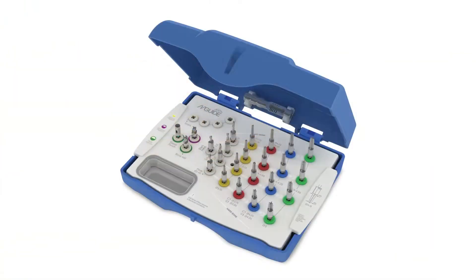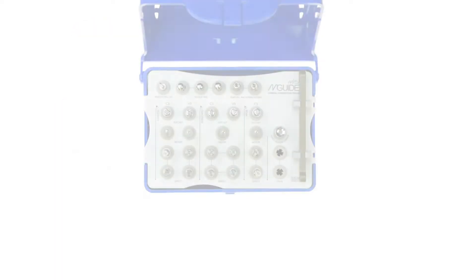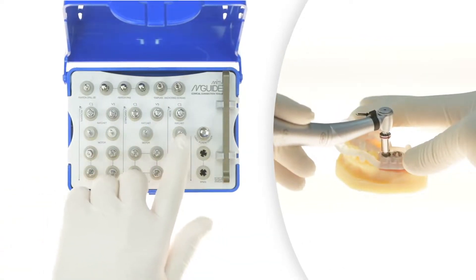Since the drilling part of the procedure is complete, we can move on to place the implant using the tools in the smaller kit of the set. We can choose whether we want to place the implant with a handpiece, a ratchet, or both.